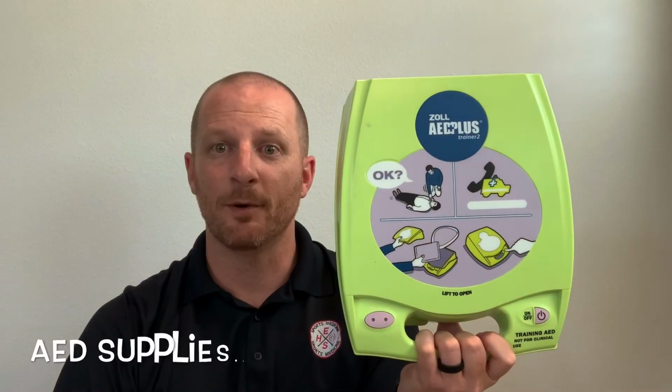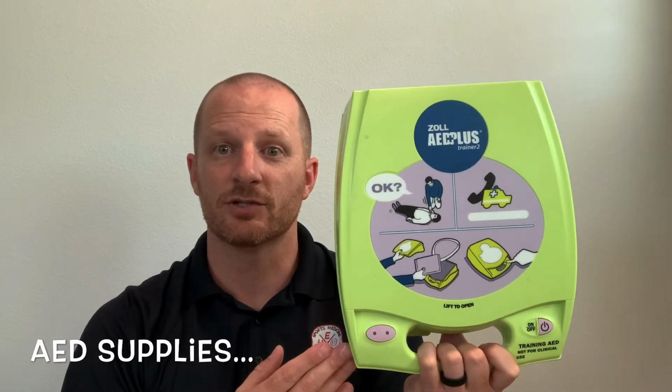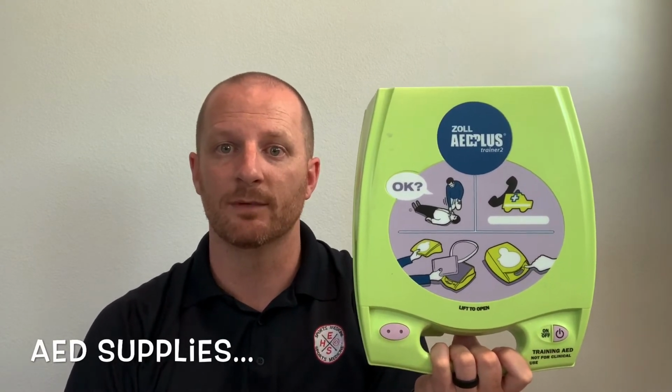Hey, today we're going to talk about an AED, or automated external defibrillator. This device can shock an abnormal heart rhythm back into rhythm. So if somebody is experiencing cardiac arrest, we want to get this on them as soon as possible.